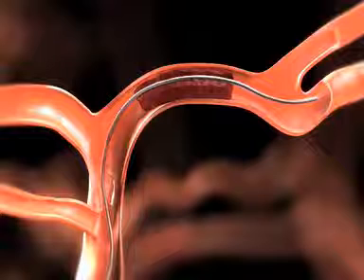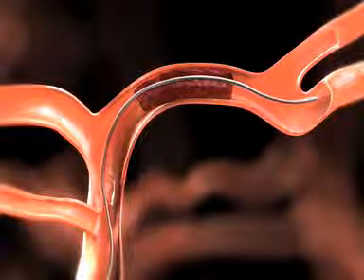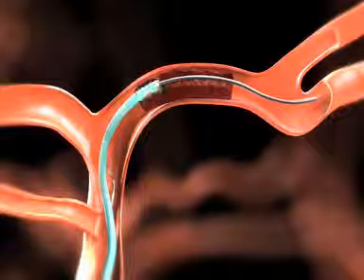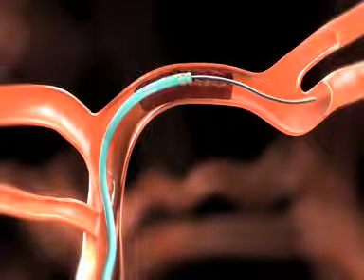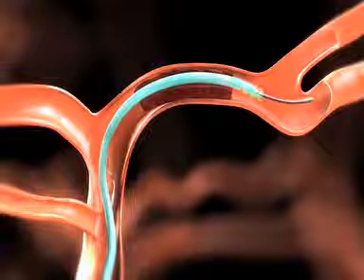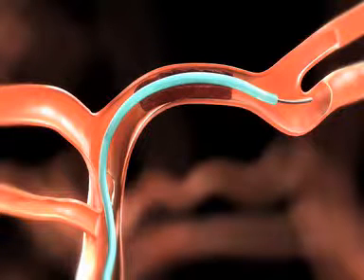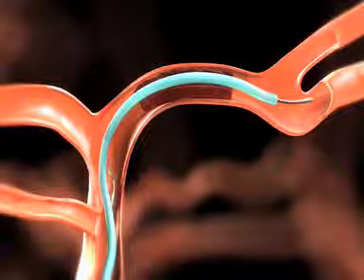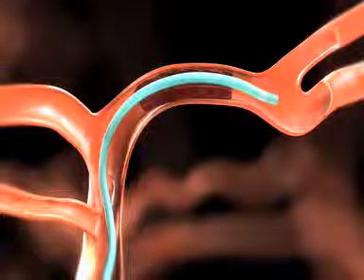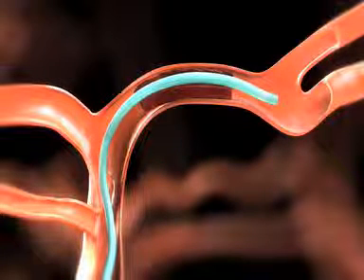With the aid of a suitable guide wire, hold the guide wire in place and advance the microcatheter. Position the microcatheter distal to the thrombus so that the usable length portion of the Solitaire FR will extend past each side of the thrombus when fully deployed. Once the microcatheter is in place, remove the guide wire and tighten the RHV to secure the catheter.